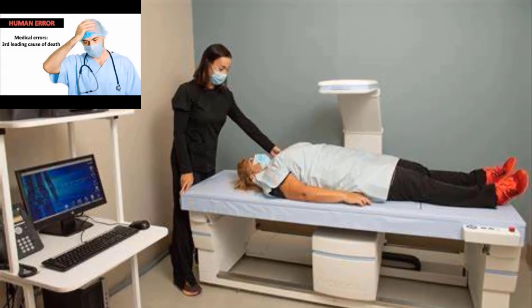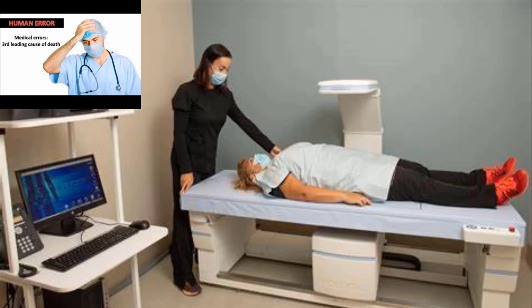Human error and medical errors are the third leading cause of death for patients in the hospital. Are human errors being made every day by all health care providers? As we alluded to earlier, DEXA is not a simple test — how well you perform it determines the quality of the examination. That's why one technician can be better than another, and one machine or facility better than another.